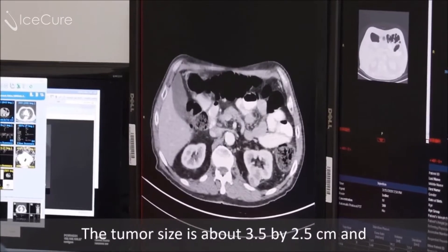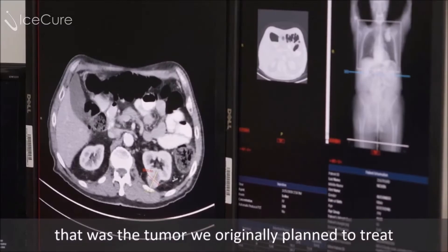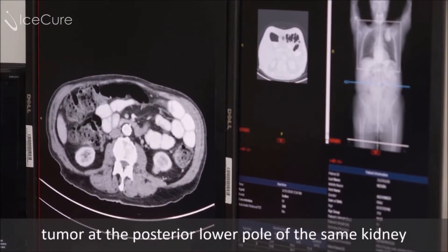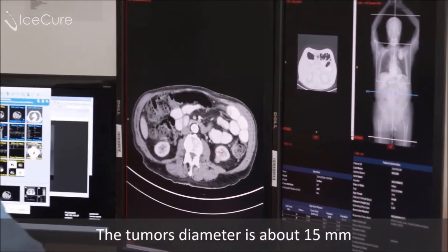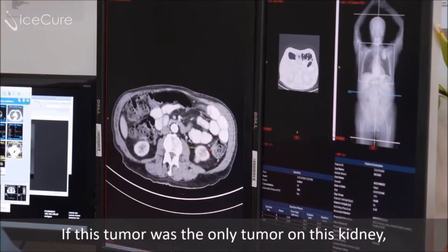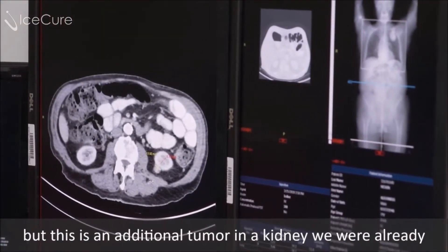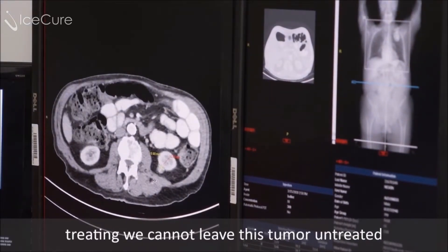The tumor size is about three and a half by two and a half centimeters, and that was the tumor we originally planned to treat. When we scroll down we can see there's another tumor at the posterior lower pole of the same kidney. The tumor's diameter is about 15 millimeters — it's a very small tumor. If this tumor was the only tumor in this kidney, we might not have treated it and chosen active surveillance, but because this is an additional tumor in the kidney we're already treating, we cannot leave it untreated.